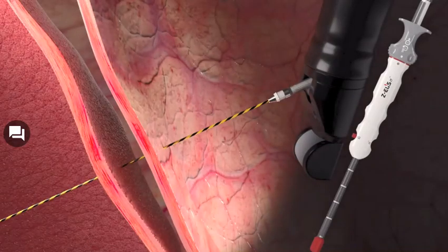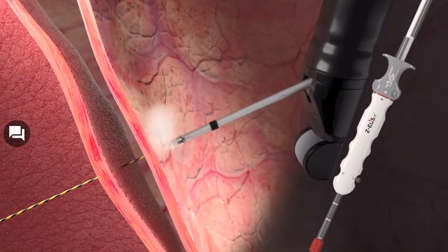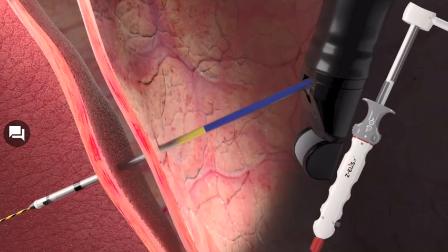Step 1. Positioning. Unlock the sheath lock and push the sheath handle to the targeted location. Make sure the generator is on the recommended setting, pure cut, and push the sheath handle downwards under EUS guidance. Stop the sheath handle at the proper position. When entering is completed, lock the sheath lock and power off the generator. And unplug the cable from Z-EUS.